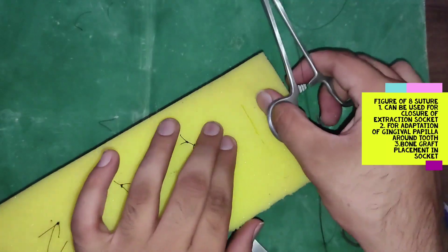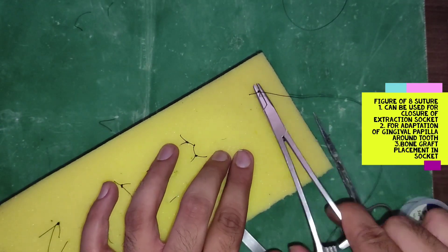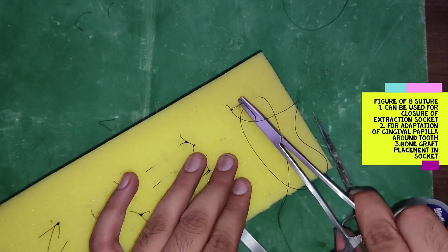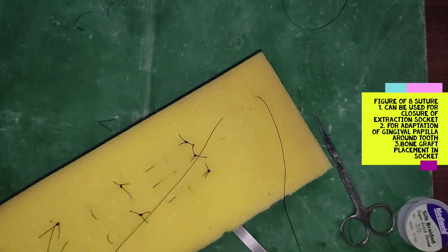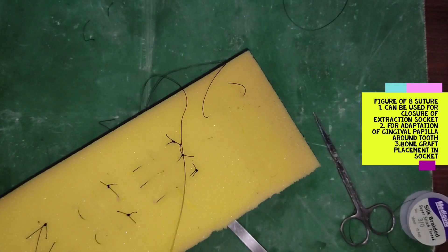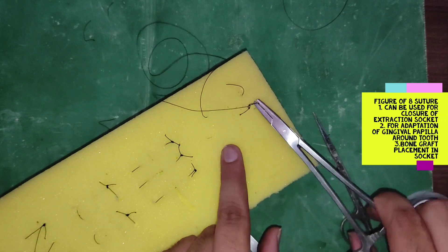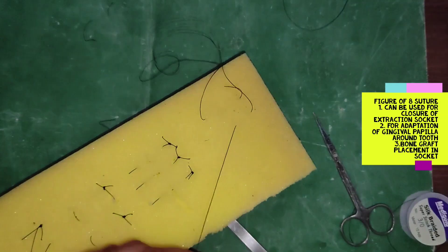The last suturing technique — and my personal favorite — is the figure of eight. It is honestly the easiest one. This technique is basically used for the closure of the extraction socket, especially with the molar ones.